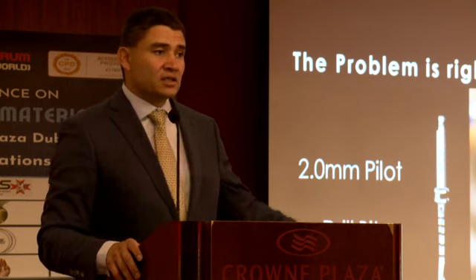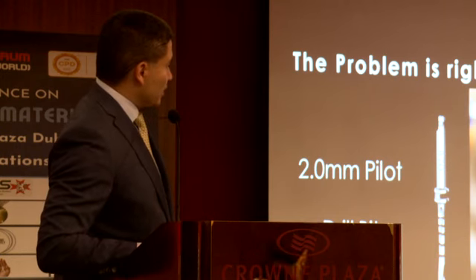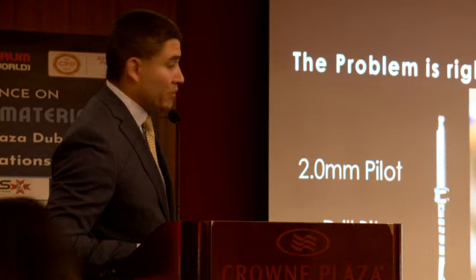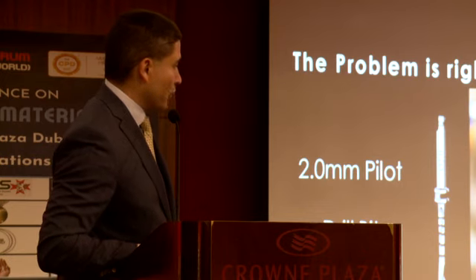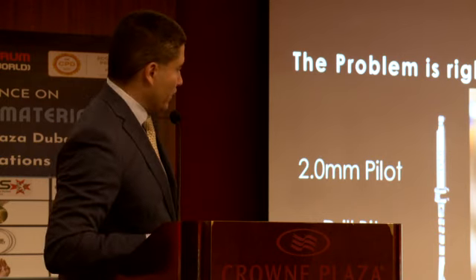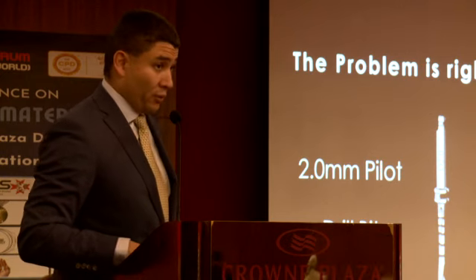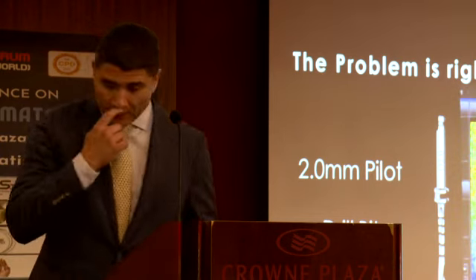What we will see in this movie, while we connect it, is the drill with external irrigation penetrating the cortex of bone, which is mimicked in this bone block by dense bone, and then the cancellous bone. This is just a wax to prevent the water from flowing everywhere, so we can document it. You will see that the bone is actually burned as we drill. Let me plug this in.